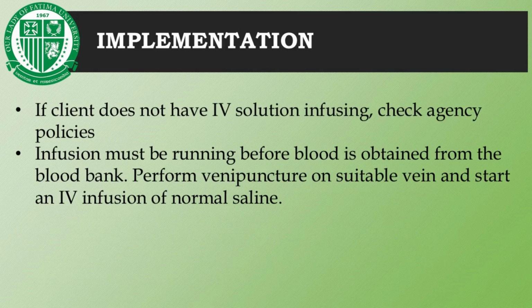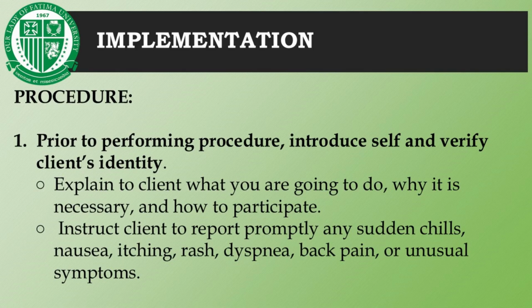But if the client does not have an IV solution infusing, check agency policies. The infusion must be running before blood is obtained from the blood bank. Perform venipuncture on a suitable vein and start an IV infusion of normal saline. Let's start with the step-by-step process.